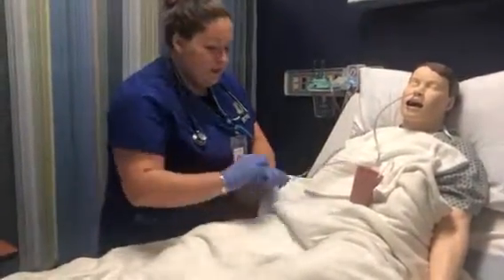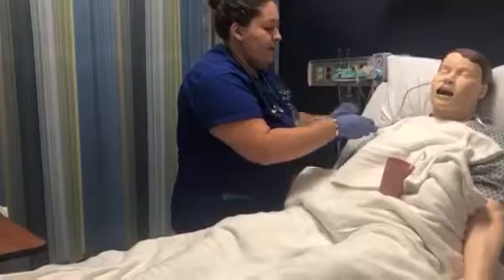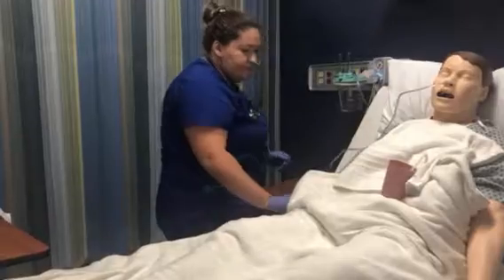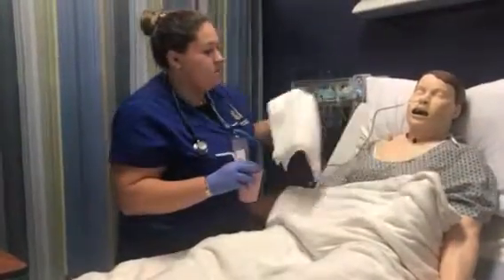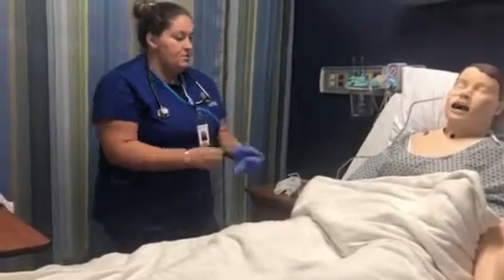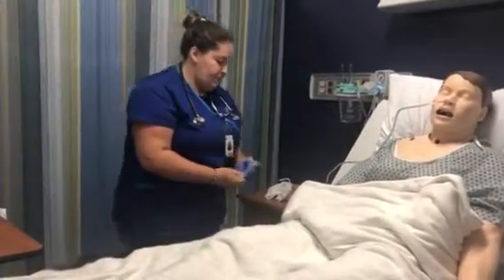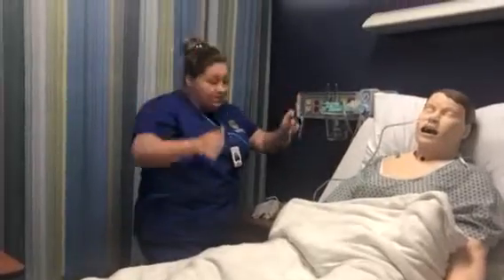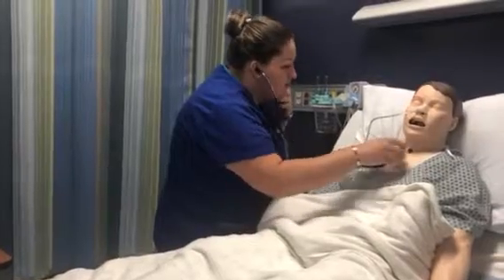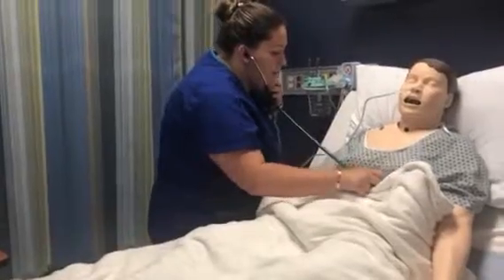Going to then cap the connector. Take the last piece of tape, connect it to the patient's gown. Okay. Discard this. Discard of my gloves. I'm going to auscultate the patient's lung sounds again.